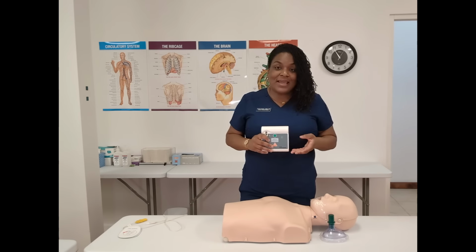They're really user-friendly. And if you work in an environment that has an AED, my request to you is, I always give people homework, I want you to take a picture of the AED. Find the name, find the brand, and then go research that on YouTube, because I need for you to know how to work your company's AED in the event of an emergency.